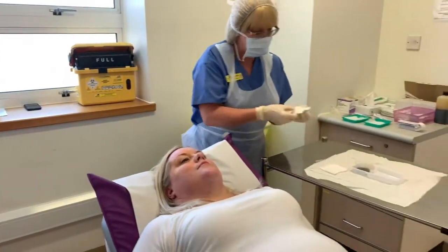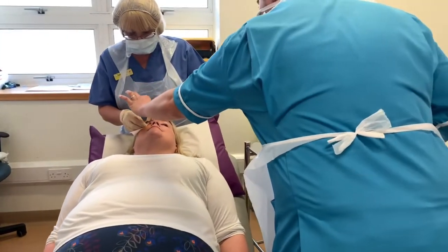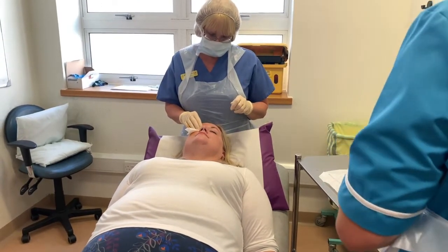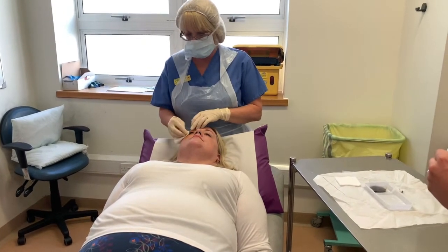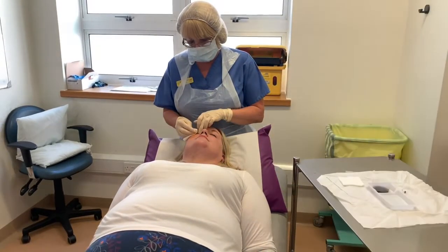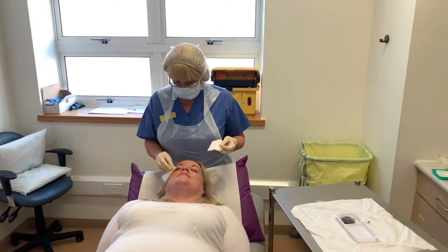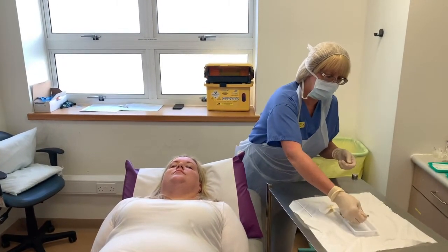So I'm just going to pop some antibiotic drop in there. So if you look over to Ashley, I'm just going to pop some drops in there. Can you shout for me? Now if you look over to your left again. Some lubricating drops just to make that nice and comfortable for you. Okay. How's that feeling? Is that alright? Lovely. So I'm just going to give the eye a little clean around just to get rid of the iodine.